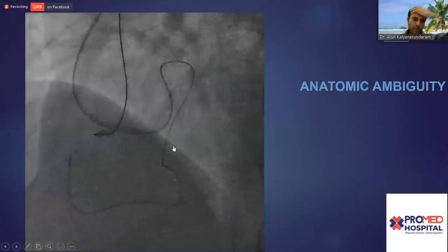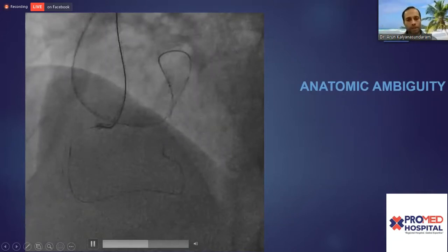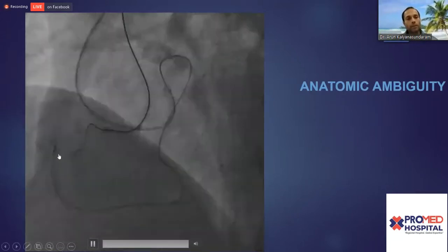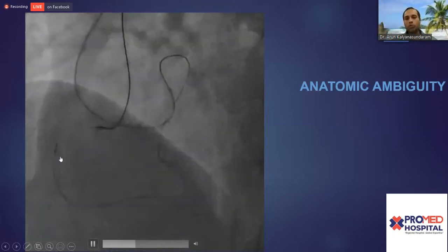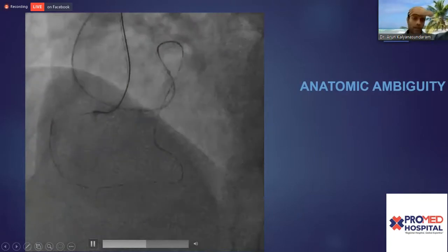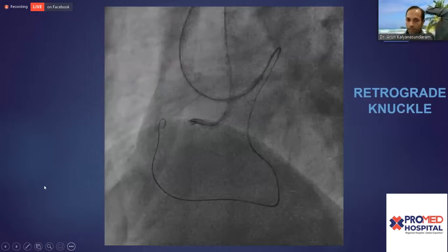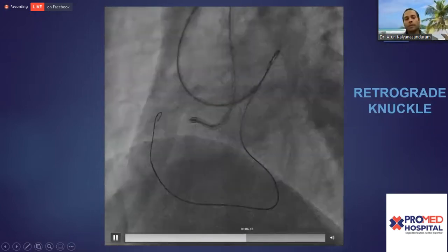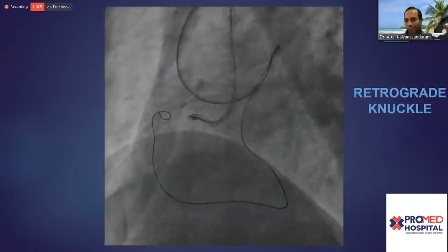Here is a case that I did in China. Again, this is retrograde, but the principles still remain. The antegrade wire is coming down. The retrograde microcatheter and antegrade wire seem to be super far. This is a radial femoral approach, I think. So retrograde knuckle, again, if you look at it, it's going somewhere else. I was really not comfortable with the anatomy. There was no CT up front. And I'm like, where is this going?